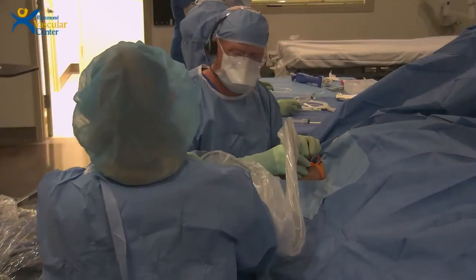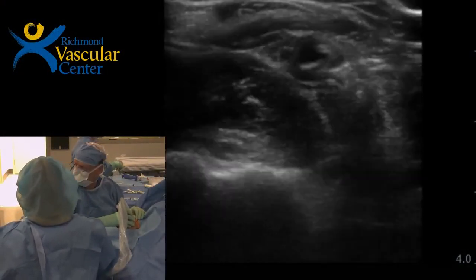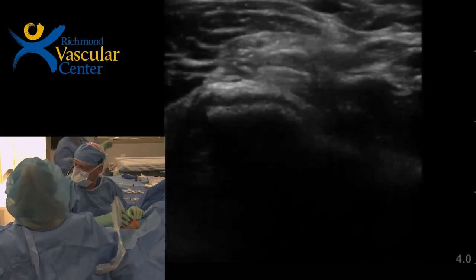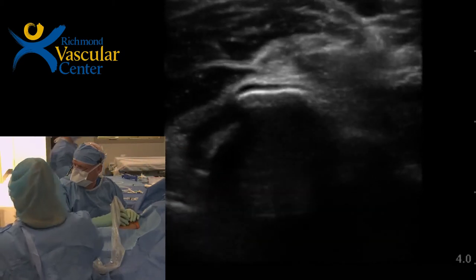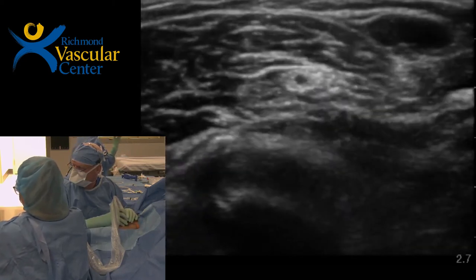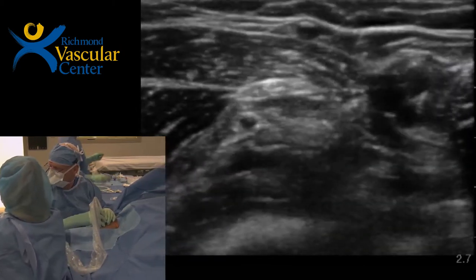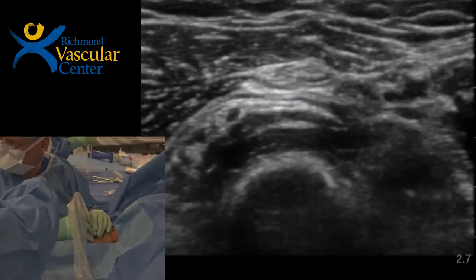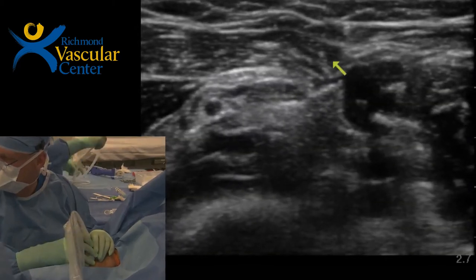All right. So okay, so here's the basilic vein. Let's mag up a little bit. Coming down, and then cephalic. And then there's our perforating vein. So you can see those are the veins around the radial artery. And there's going to be our crossing point right there.